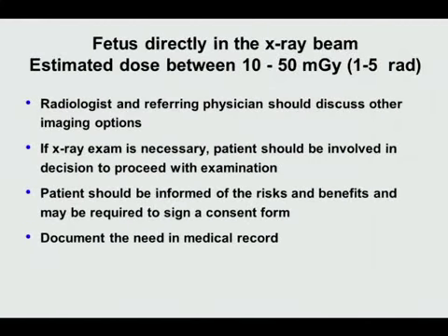If the fetus is directly in the X-ray beam and the estimated dose is between 10 and 50 milligray, that's about 1 to 5 rad, the radiologist and referring physician should discuss other imaging options. If the X-ray exam is necessary, the patient should be involved in the decision to proceed with the examination. So the patient is also part of the discussion about the risks and benefits of this particular procedure. The patient should be informed of the risks and benefits and may be required to sign a consent form.